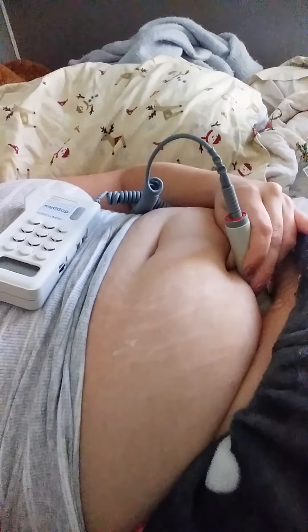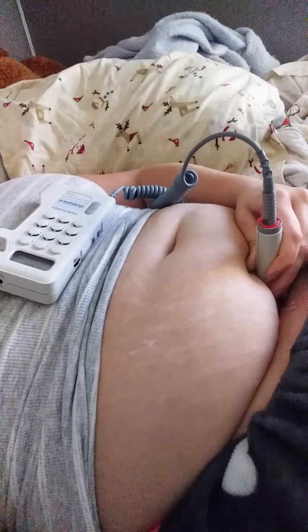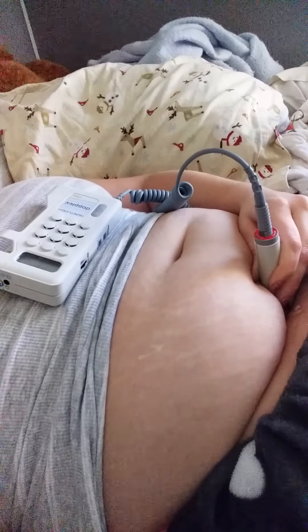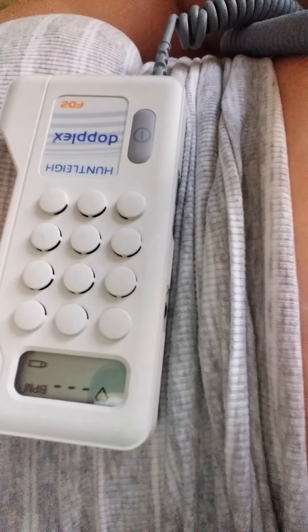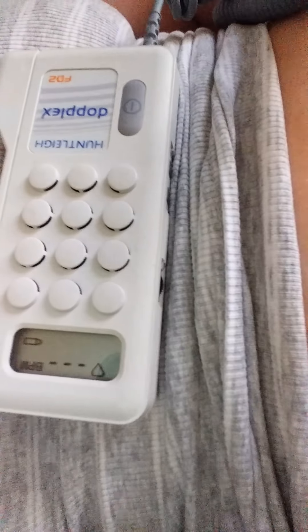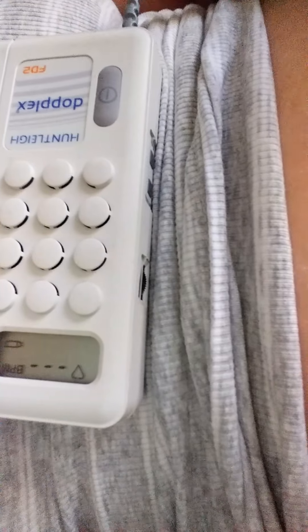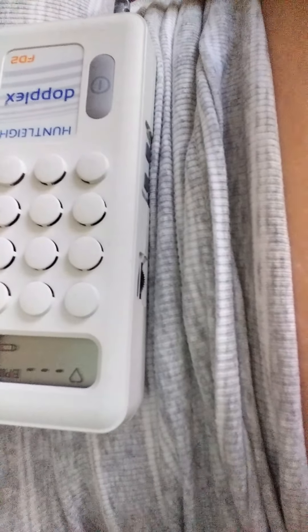So now to differentiate between my heartbeat and the baby's heartbeat, you tend to go into the middle and you can push pretty hard — and that is the baby's heartbeat. Sometimes it's a little tricky to get it, but you can tell by how much faster it is.